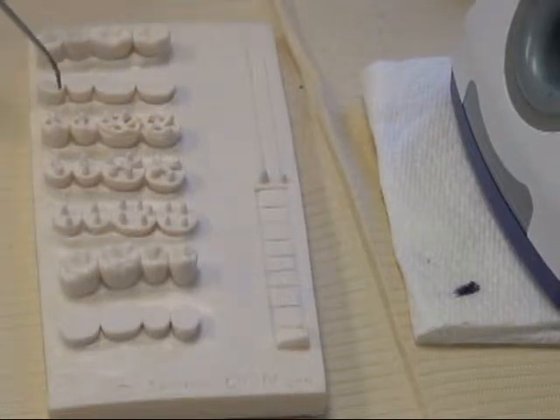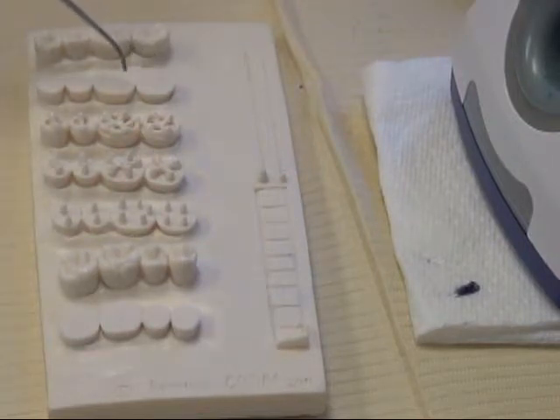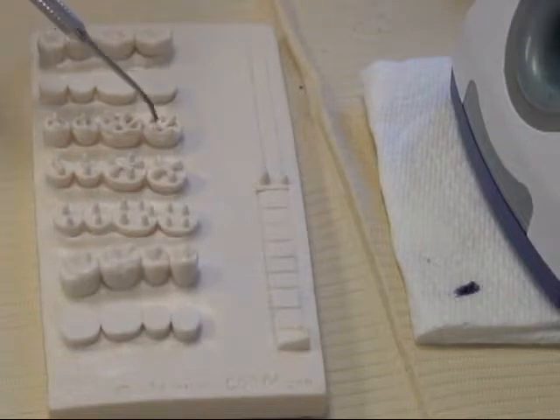This block here is for you to practice on. So you'll use those steps. Okay, I need cones. I need to put cones here, and then I'll connect the cones, and then I'll do the circumferential parts, and then we'll put in the root grooves and finish off the waxing at this point.